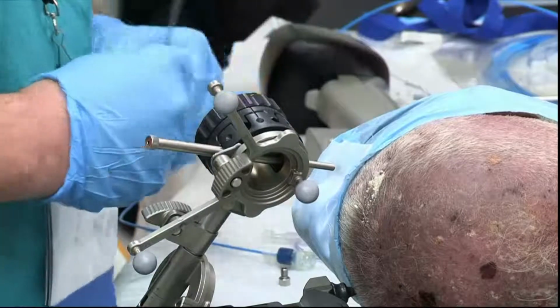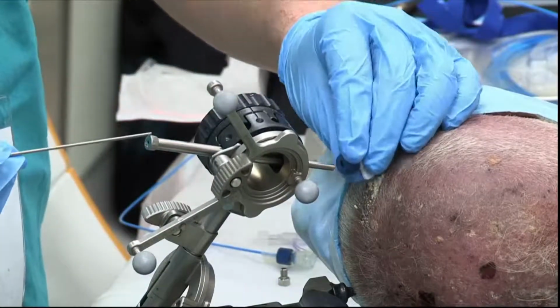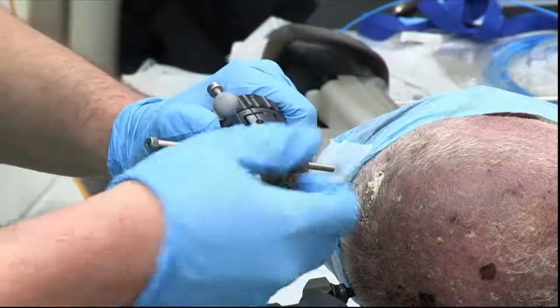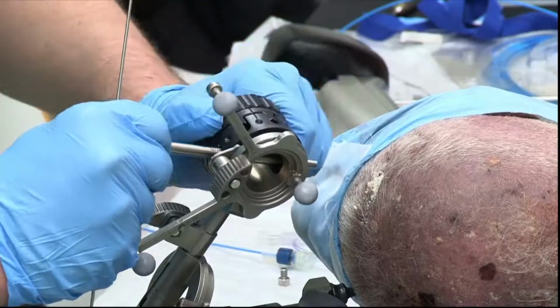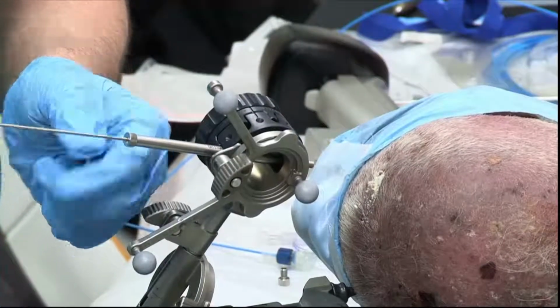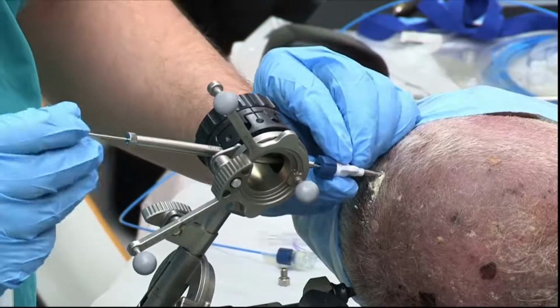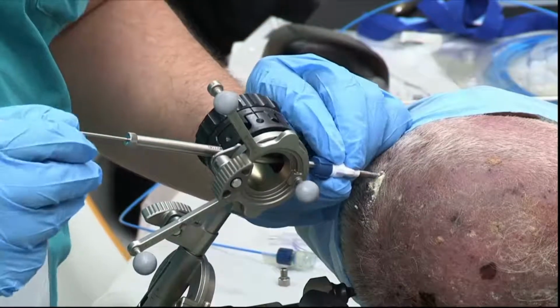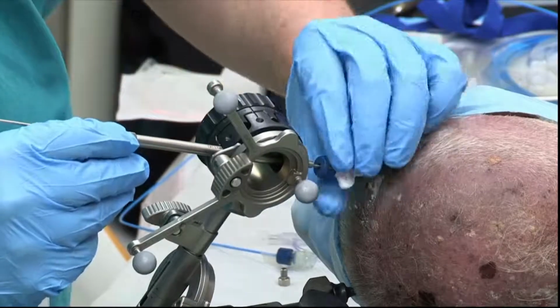So we have our bolt. And let's back that up a little bit more here. So this is going to secure our trajectory.